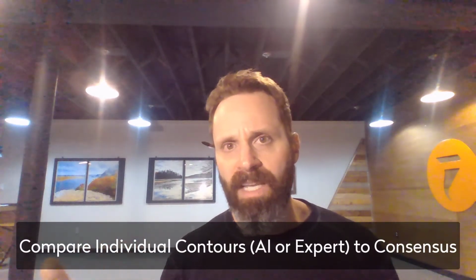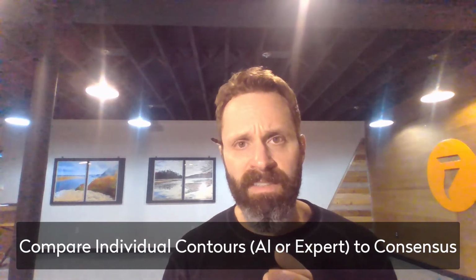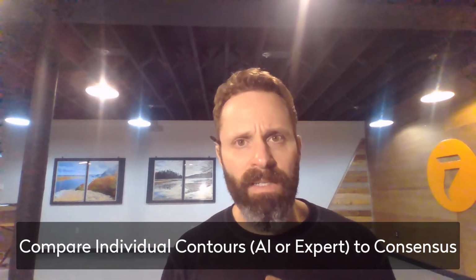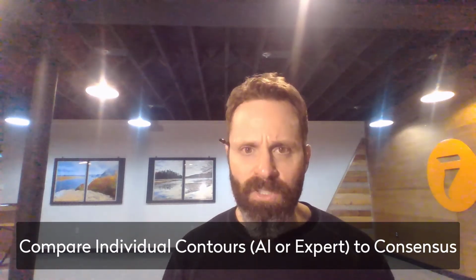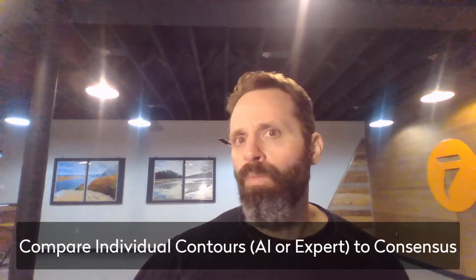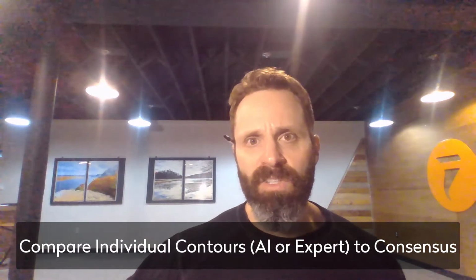And then what I think we'll do before we move on, this will be interesting, and this is to tee us up for the next few podcasts I'm going to do, which is going to be to meet with an AI vendor one at a time and look at their AI auto-segmentation engine results versus the population consensus, and see if there's some kind of level of consensus that starts to look like what an AI engine would generate. So we're going to emulate that, but we're going to use 1 or 2 of the expert physicians who were part of the panel. We're going to use their contours just as a model for that, and that might turn up some interesting things there as well.